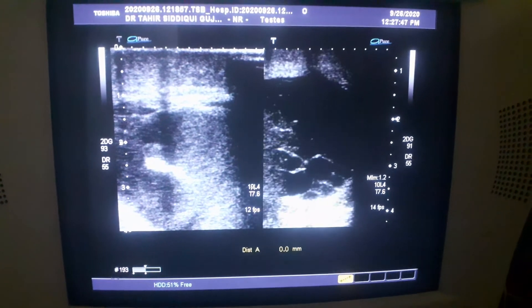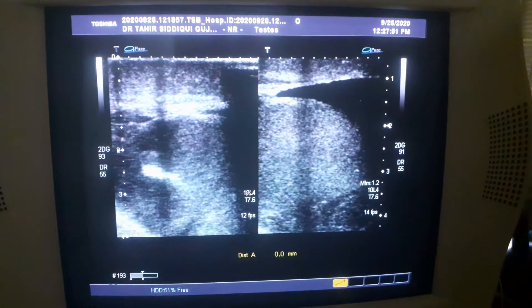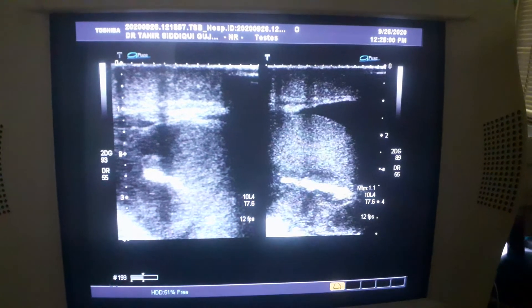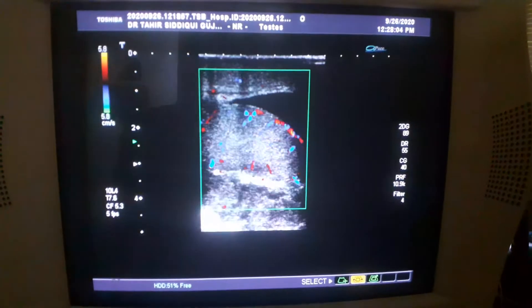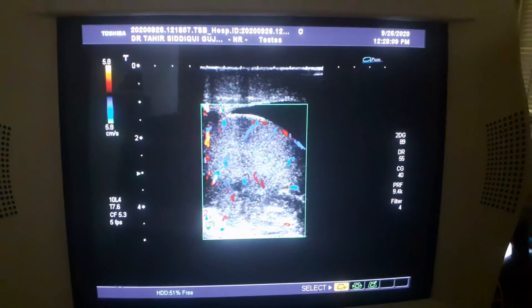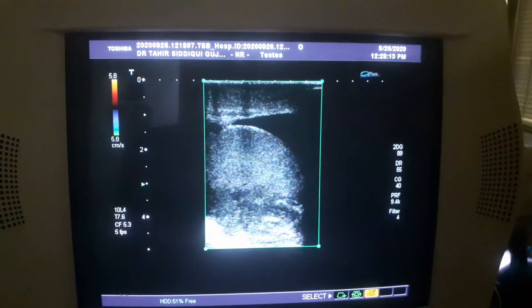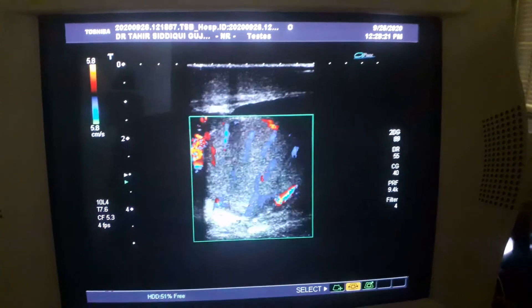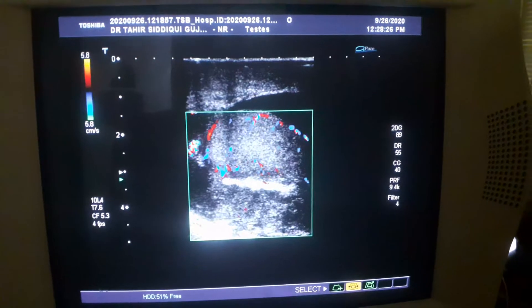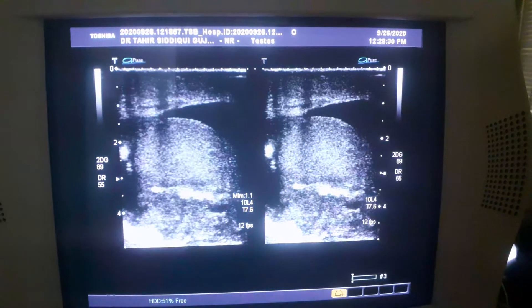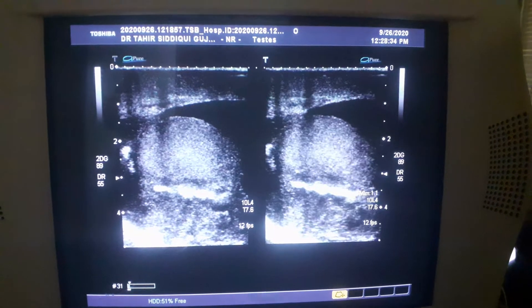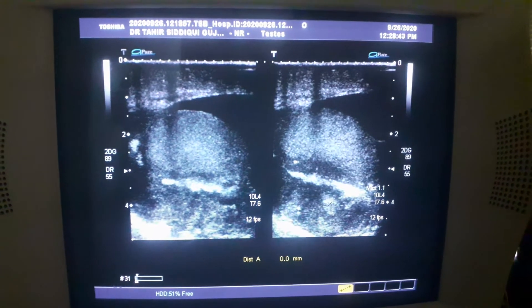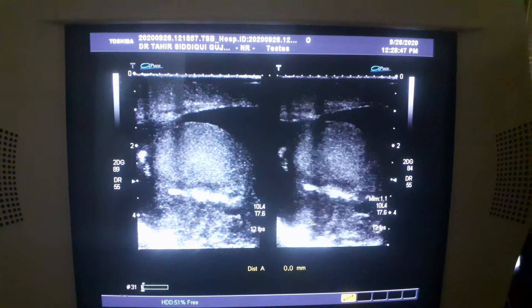This is the fluid in the right hemiscrotum. Here you will see the testes, and in the testes you see the posterior area. The testes show normal vascularity. However, if we concentrate, we see that there is a lot of debris — thick debris with internal tiny calcifications, punctate tiny calcifications.